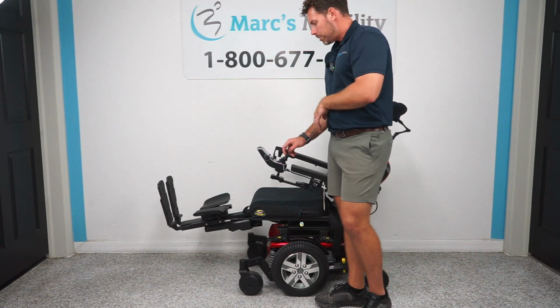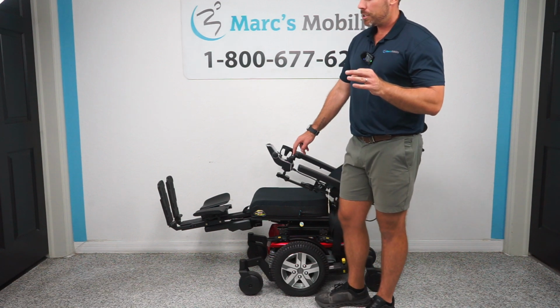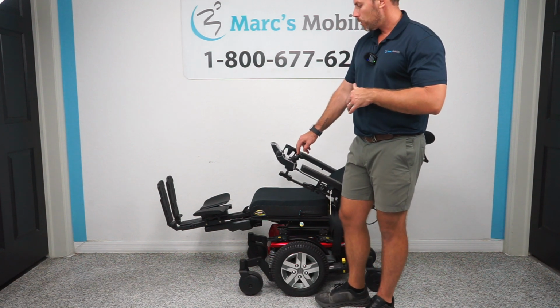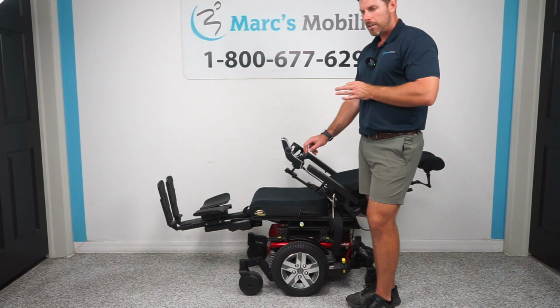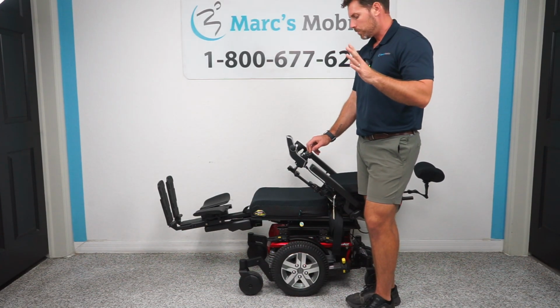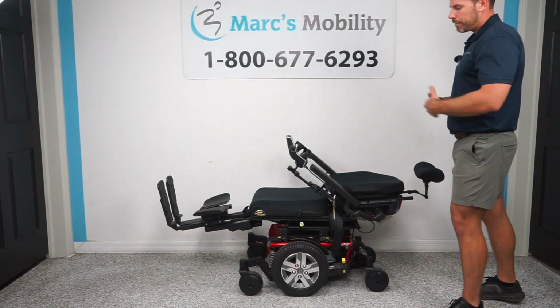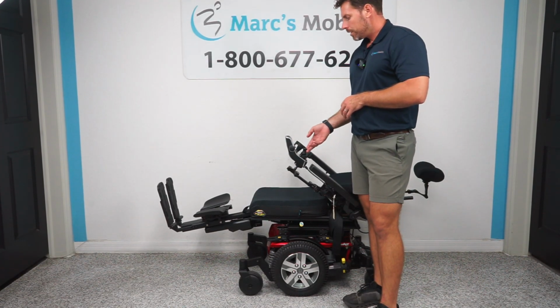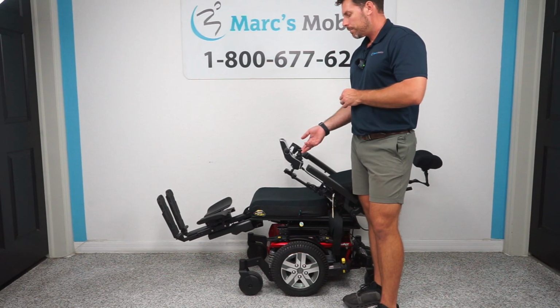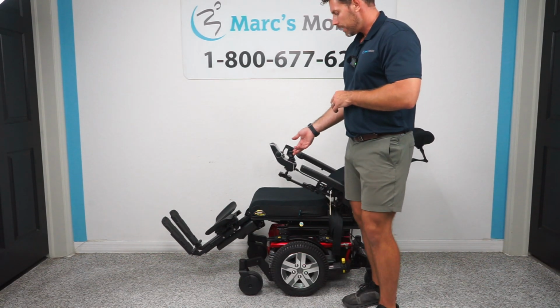One other thing I'll mention to you as well is on the screen, you're going to have a green circle when you're in an upright seated position. As you begin to tilt back and or recline, that circle will then become a red X. That means you're not in a safe driving position. You must get back up to a normal seated position for you to be able to drive the chair. But this is what you'd be looking like here if you were in that kind of lay flat position. And you are able, through the joystick, to do the back and the legs at the same time. Those are the only functions that you can combine at the same time through the joystick itself.